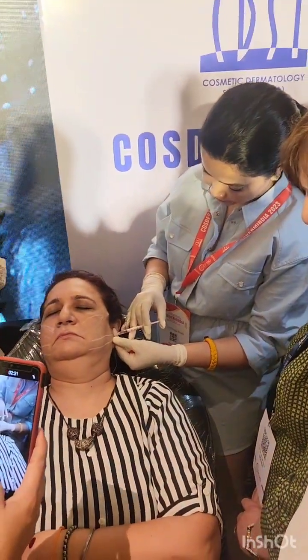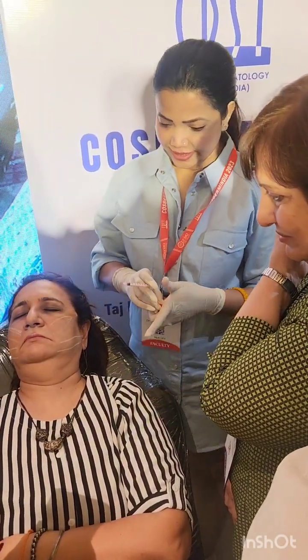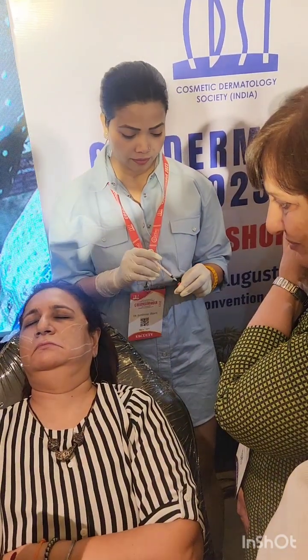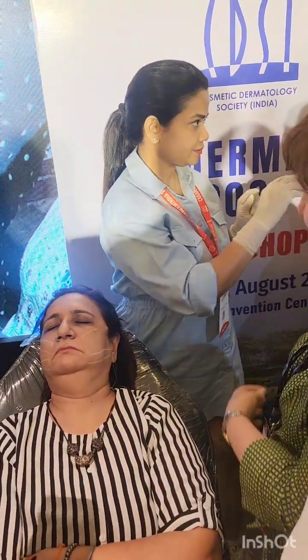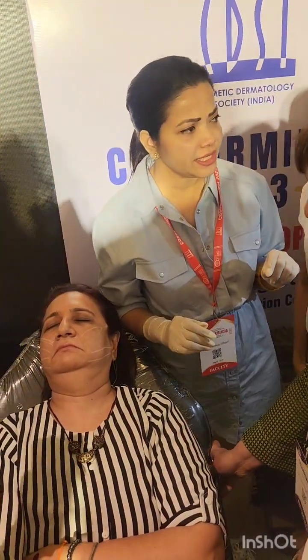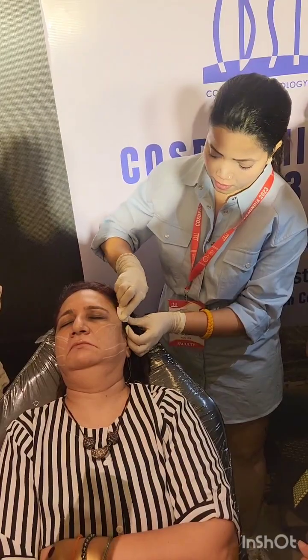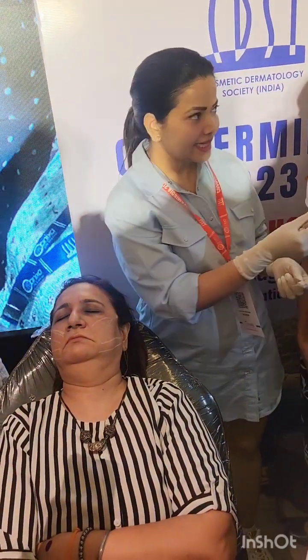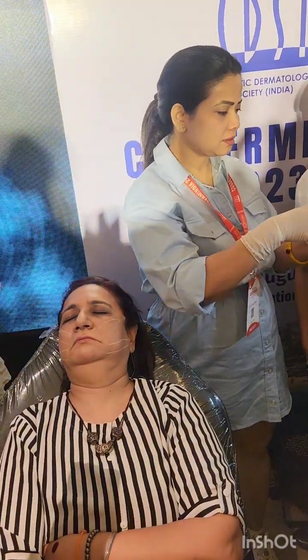Go ahead. I'm listening. Around how many threads, ma'am? Around 20. We are doing cogs, not double needle. Ma'am, I'm just cutting. Do you have that? Make one or two videos.